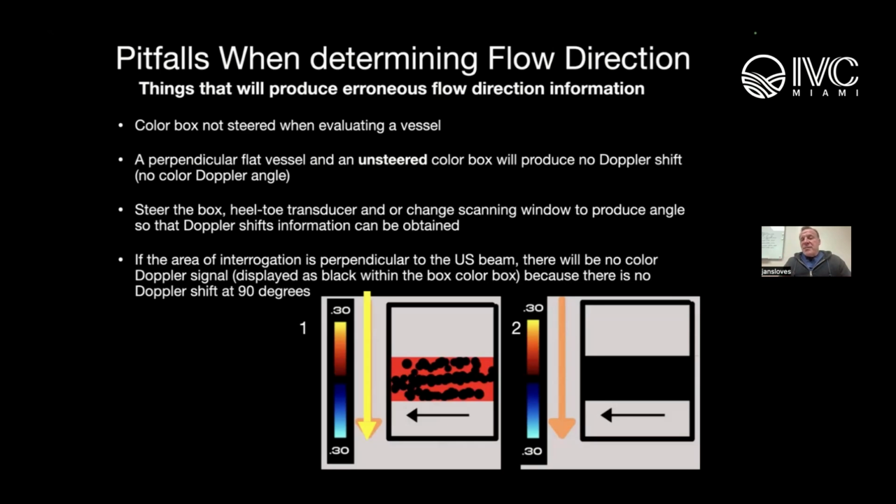But many of these manufacturers now, with the newer systems, give you the ability to fine tune this, so that you could, in some cases, have a vessel that's going straight across, but they're able to align the Doppler angle and still create a 60-degree angle for us. That's been happening for a while, and we'll get into that a little bit further out.